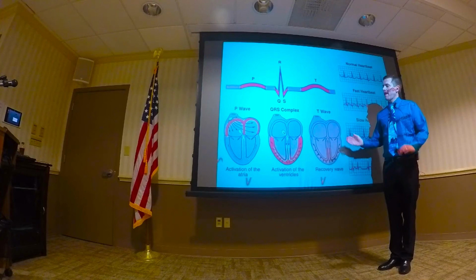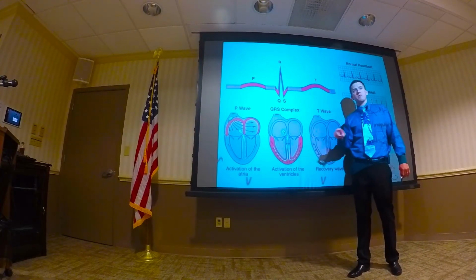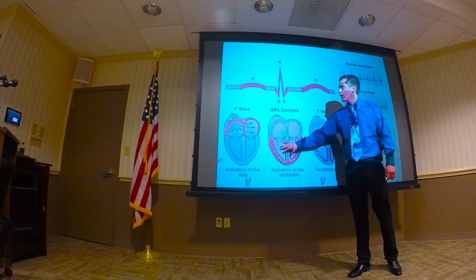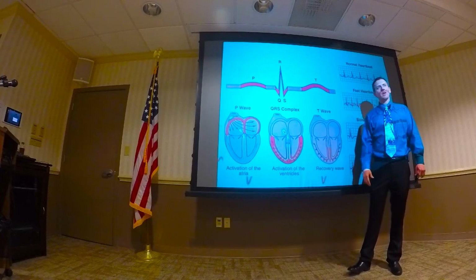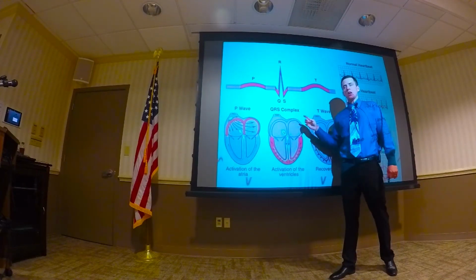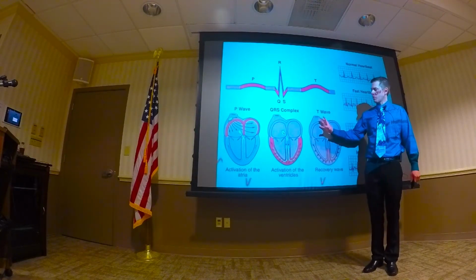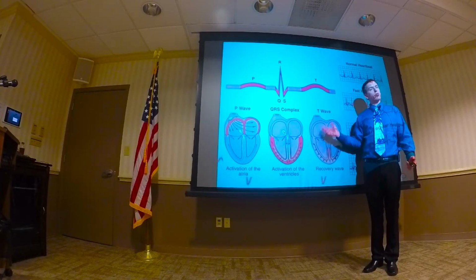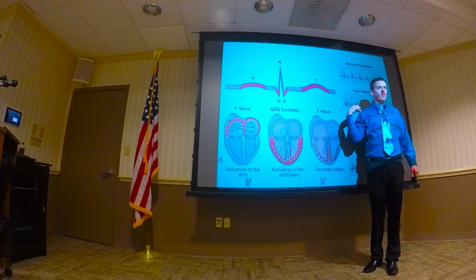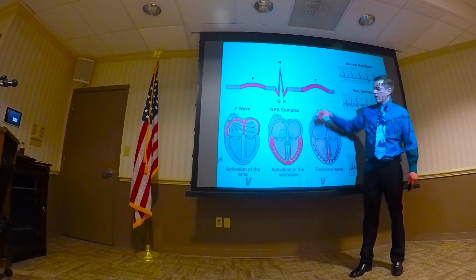So again, going back, an individual cell would not give you this kind of a wave, right? It would give you that action potential that we looked at on the previous slide. The collection of these cells is what gives you the QRS complex. And understanding that where you put the stickers on the patient is going to determine what type of QRS complex you get. So if I put the positive sticker of a lead over here, for instance, lead 1, the sticker is on the left shoulder, positive, and the negative is on the right shoulder. So if I'm looking from this side, I would expect a Q, R, and S this way.